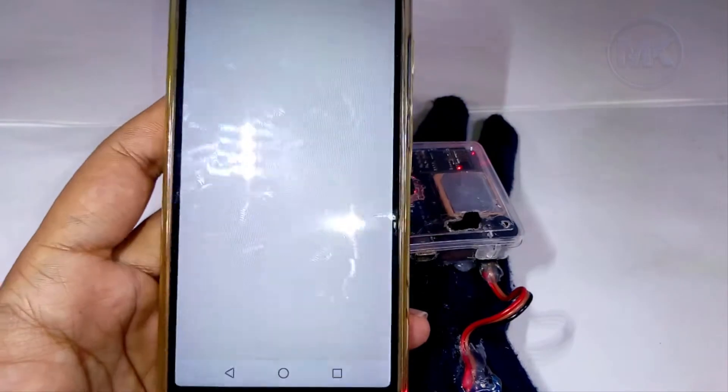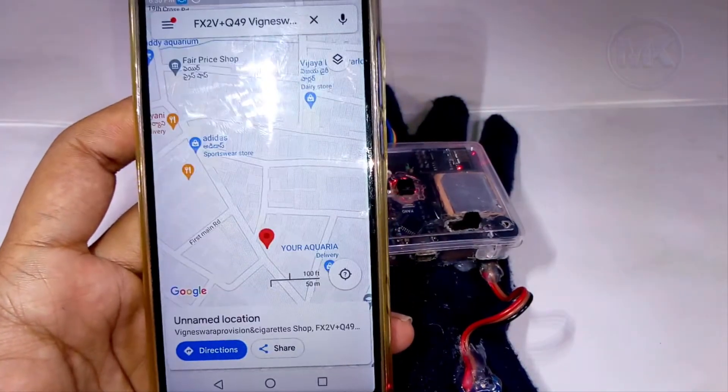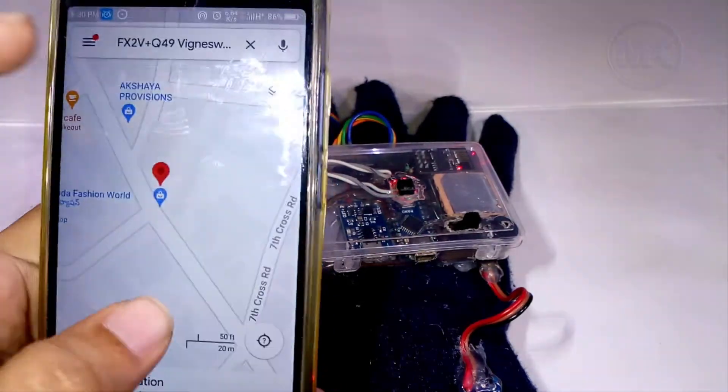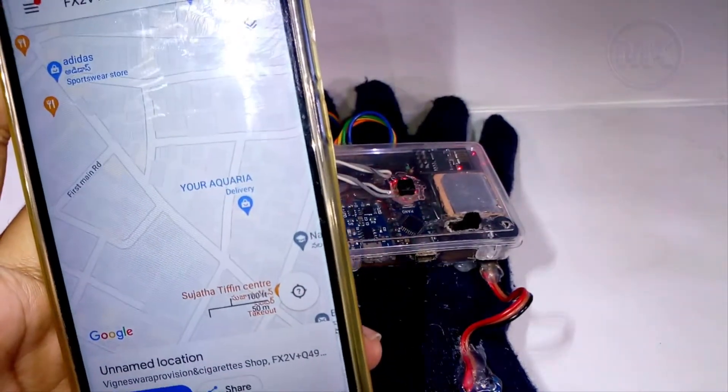This message contains the patient's health status and patient location data. If we click on the link, it will directly open Google Maps and show the location.